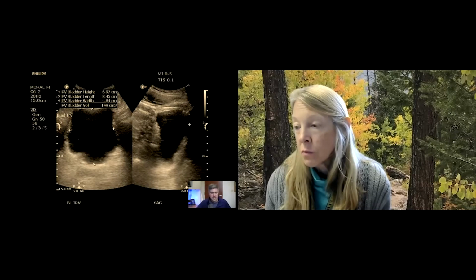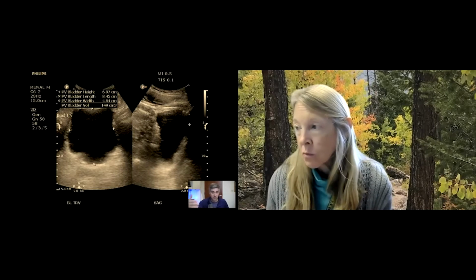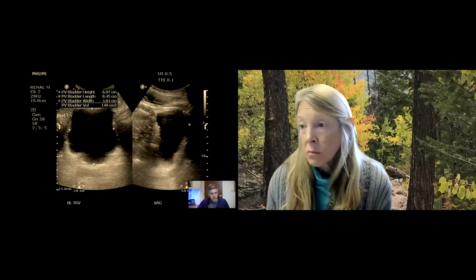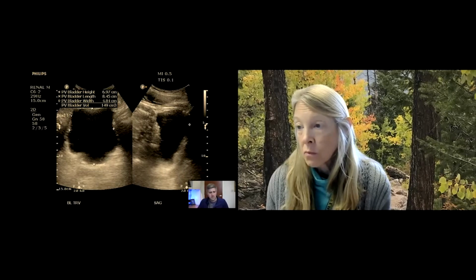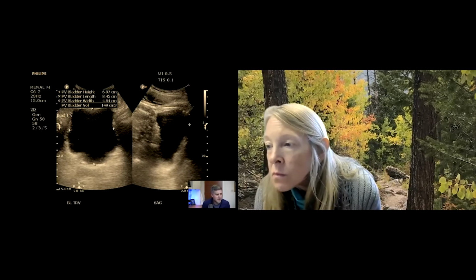So by the time you get to the posterior wall of the bladder, the deep far-field wall, the intensity of the sound that went through the bladder is going to be a lot more. There's nothing attenuating or dampening it, unlike the stuff surrounding it, where there is dampening of the sound. And so you'll have that brighter far field beneath the bladder than you will around it. That's posterior acoustic enhancement. So those are some of the sonographic anatomy features, and a little free physics tidbit, to help identify the bladder, right?